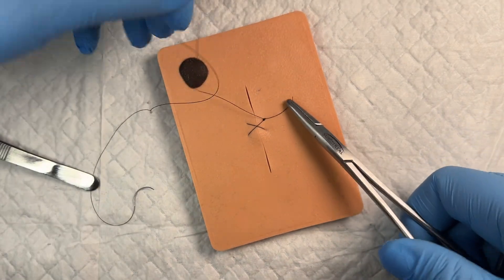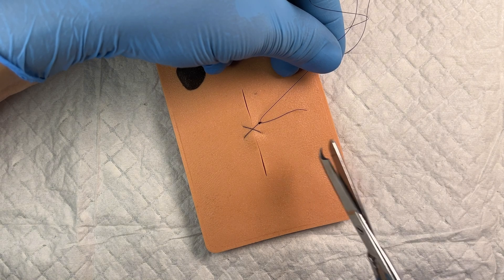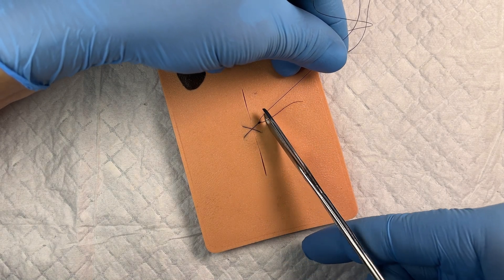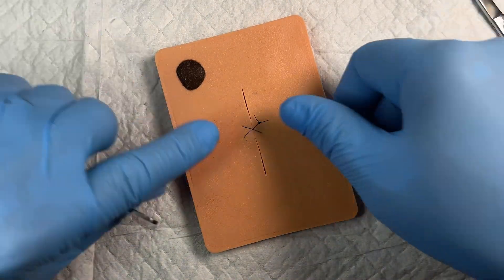And that right there is a cruciate suture. We'll go ahead and grab our scissors and cut it so the tails are plenty long but not too long. And there we go.